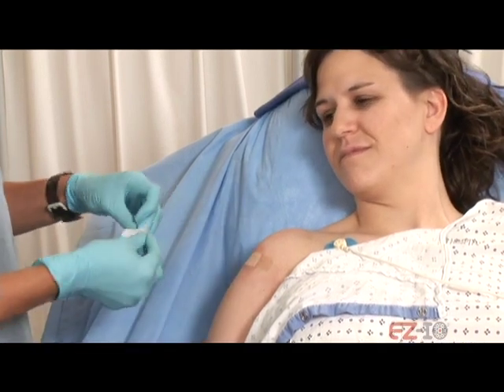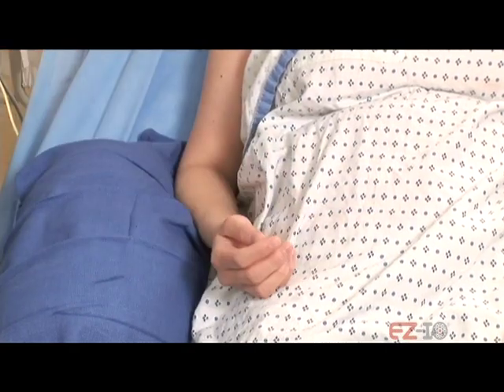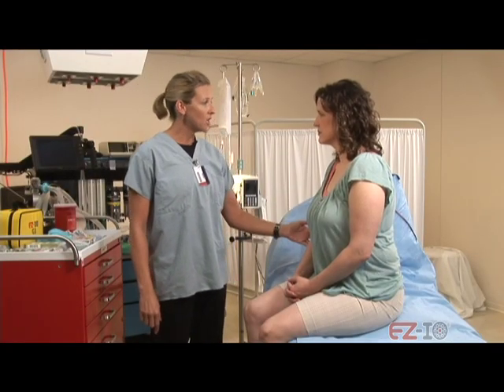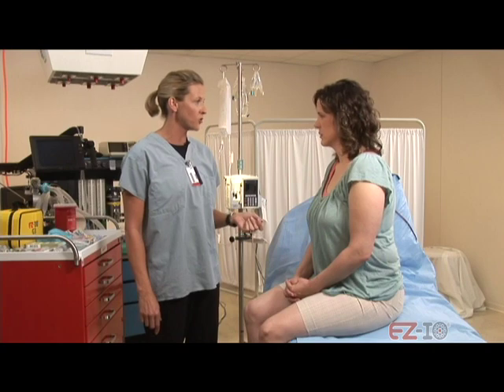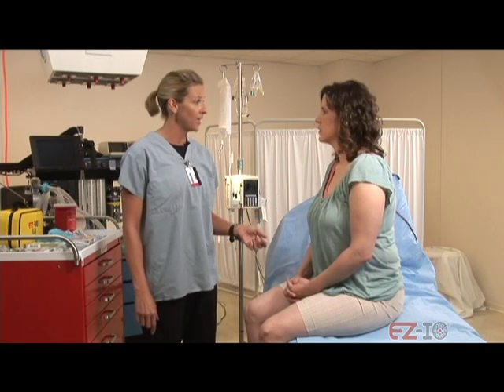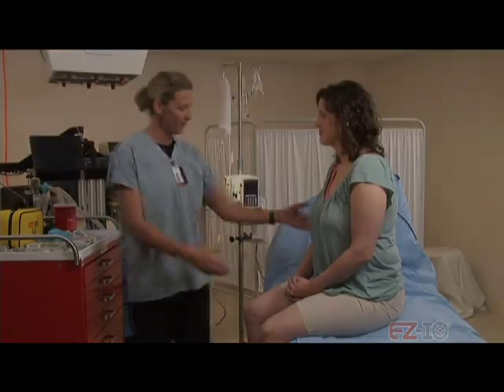Now we'll just get that wristband off you. There we go. Following removal of the Easy IO, inform the patient that soreness is normal for up to 48 hours. The patient should be able to assume normal activities as soon as their primary medical condition allows. Finally, if the patient detects any signs of infection or other problems, they should contact their primary care physician.